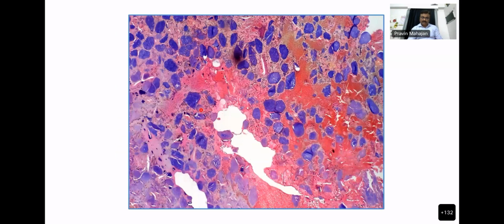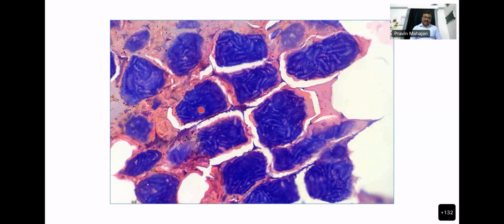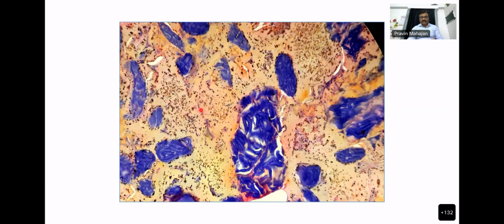These blue structures can be seen on high power. You can make them out again on high power. You start to see they're more rectangular, which is quite unusual for any human tissue. And elsewhere, apart from these bluish particles, the spaces in between look yellowish. Quite an unusual structure.